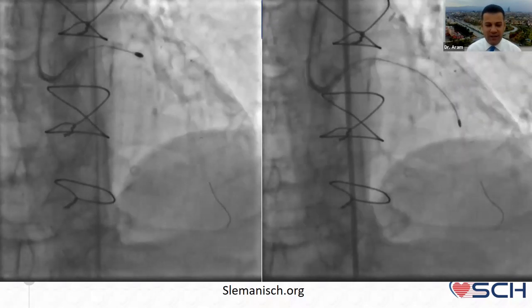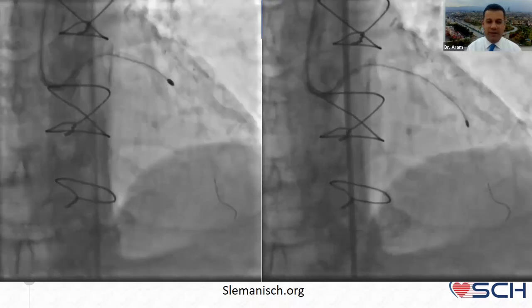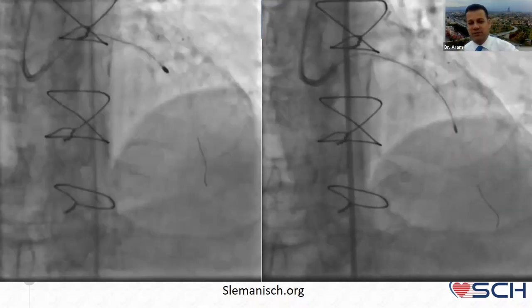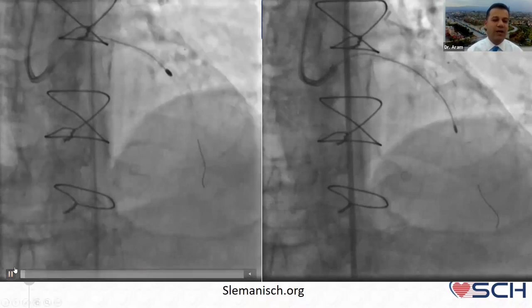You cannot find it if you don't care about it. You will find your wire is going to the RCA, going anywhere, I don't know. But you should be very careful. And why I brought this case to you, because if you look at my guide, it's not well fixed. It's not well hooked. It's not hooked to the left main.